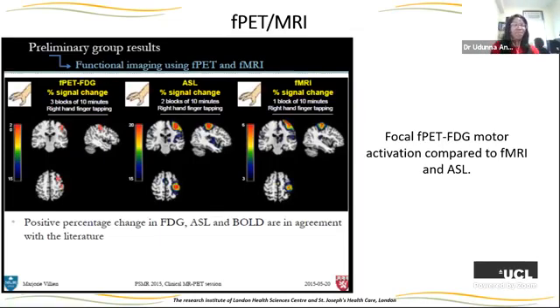But it's very time consuming to do that type of experiment. Typically you don't get much with CASL compared to what tends to be now the common approach, which is pseudo-continuous, a variation of the CASL technique, except you don't need that two-coil system. You can do continuous pulsing of your area of interest. In this case, it's in the neck. Mind you, ASL can be done anywhere in the body.